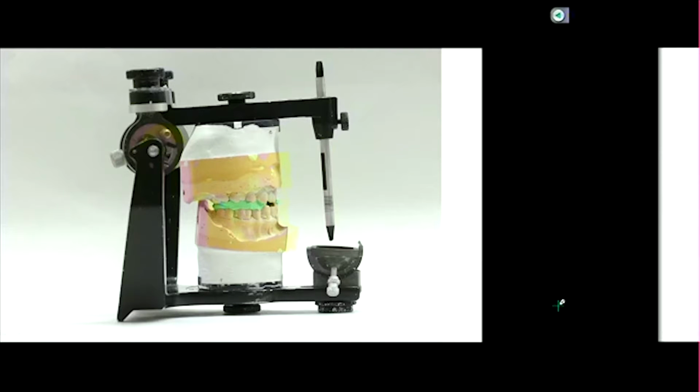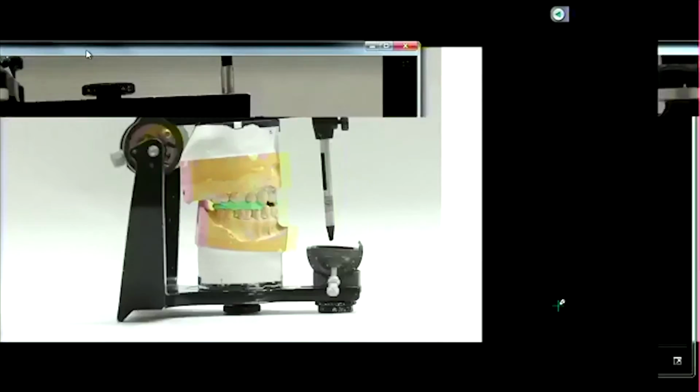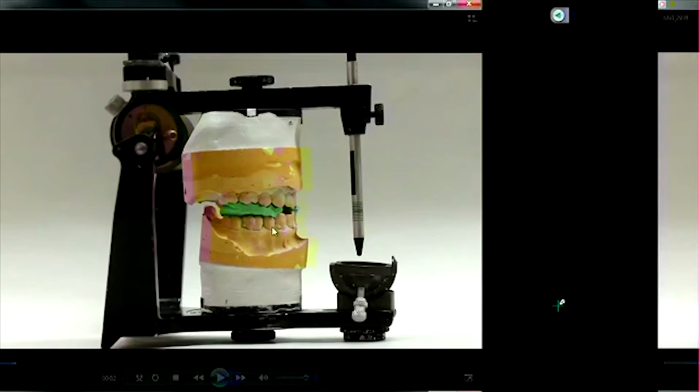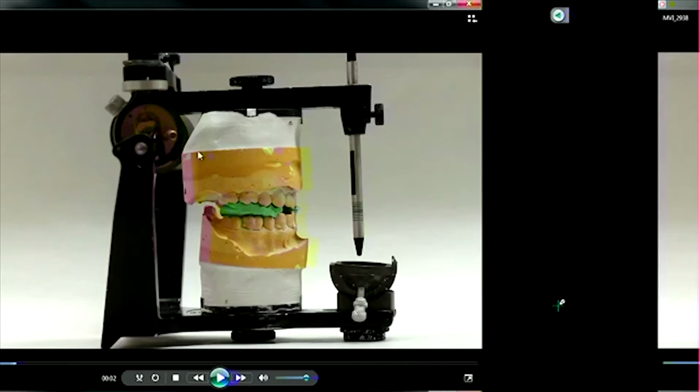Now we've moved away from the patient's mouth. Now we got this set up on our articulator. So we get molds of the patient, mounted on the articulator. We'll unlatch the hinge. So if you unlatch the hinge, you can get them in that edge-to-edge position. So you can move the equivalent of moving the lower teeth forward, and then you put the bite records in. And then in this articulator, it just looks a little different, but this here, as you rotate that, that changes the condylar inclination.